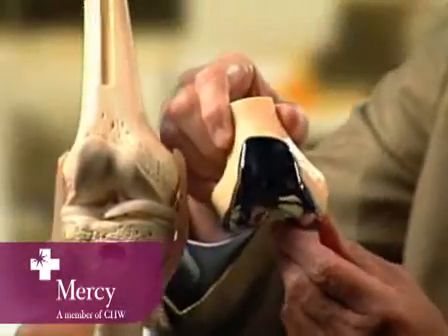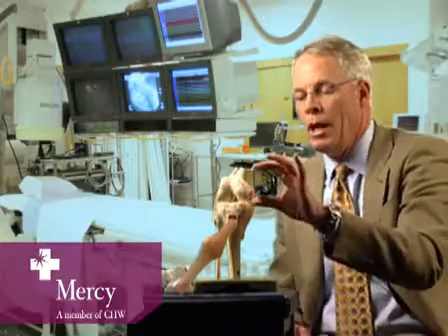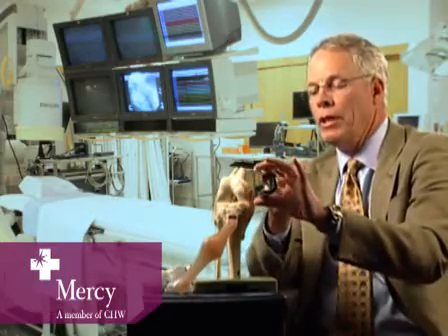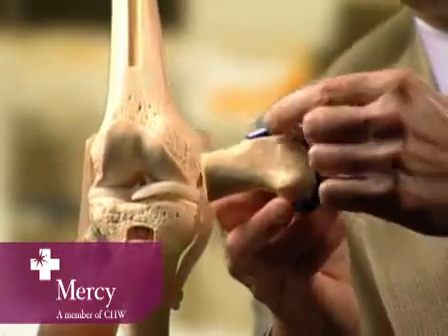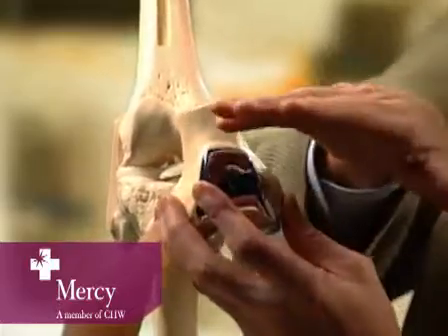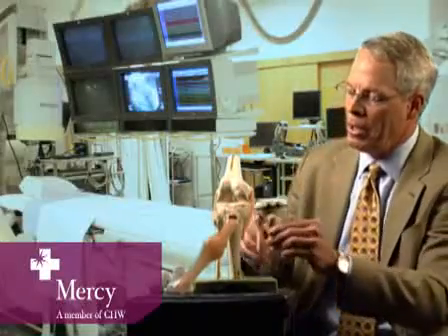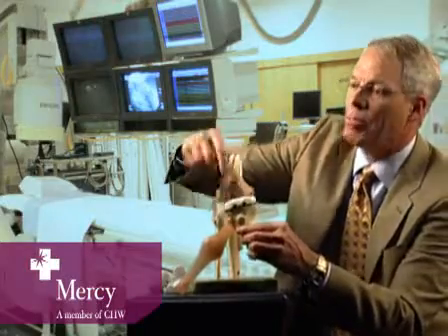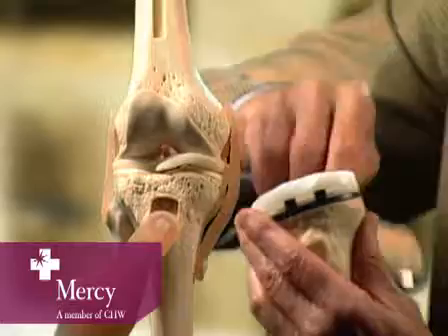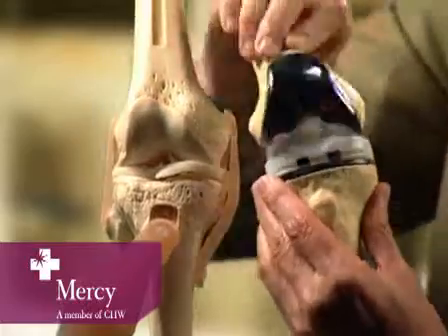A knee replacement involves this piece of metal — it fits like a cap, almost like a crown on a tooth on the end of the bone. When you look at the piece from the side, it's interesting how little bone is actually removed. We just shave enough bone off to fit the metal back on. All we do is shave a little bone off and put this piece on the femur. Then on the tibia, we have a piece of metal that gets cemented down inside the bone and a piece of plastic, so the metal moves on the plastic. We're essentially just resurfacing the bone, putting the pieces on in the exact same place where the knee was before — that's what a knee replacement is.